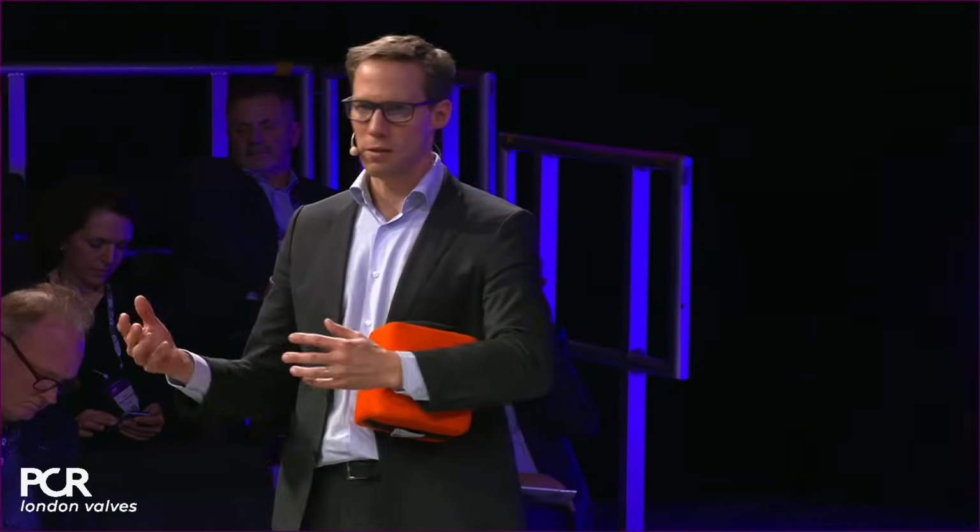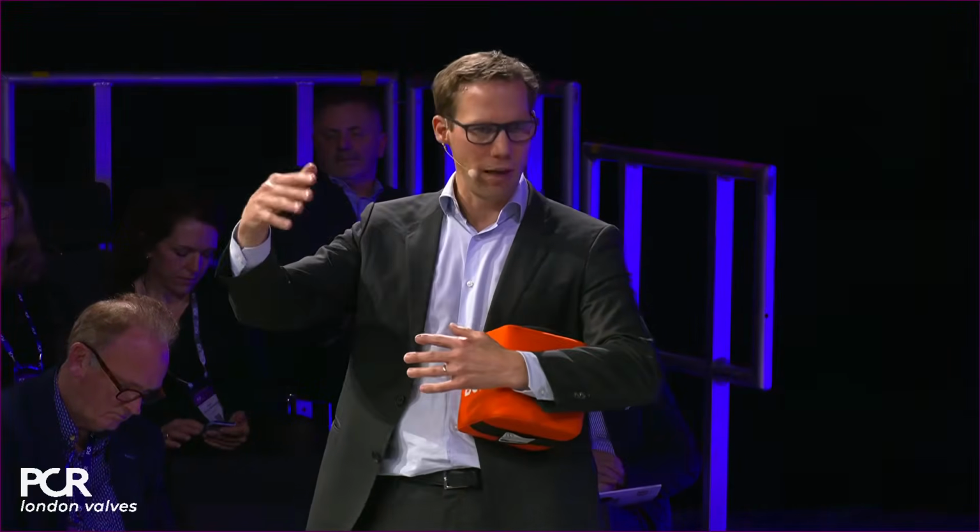The object of this is not to say who's right and who's wrong in terms of sizing. The object is to get people to think about, in a bicuspid, how much calcium is above the level of the annulus, and to consider how aggressively they need to predilate and whether they need to, on occasion, take a smaller valve. That's all. It's not to say who's right and wrong. The penalty could be, if it's truly bicuspid, meaning it will not open, infolding and so on, or seating down due to the stored tension. But if it opens, that's certainly no penalty with high coronaries with a reasonably large LVOT and sinus, and even a bigger one would work just fine.